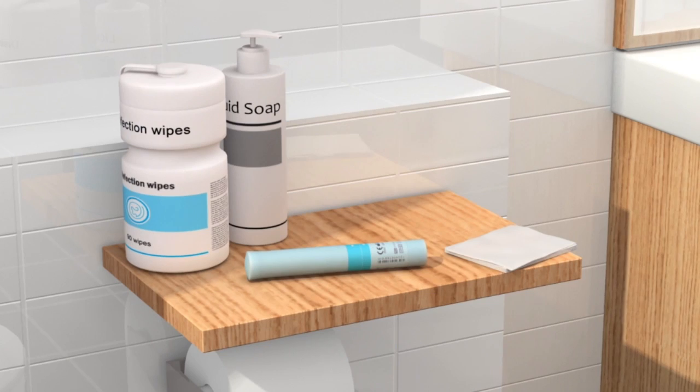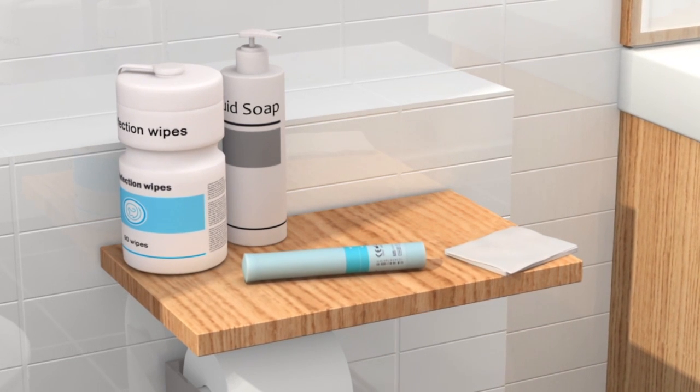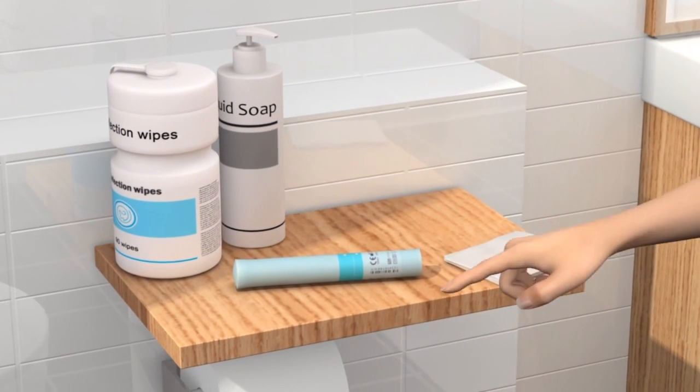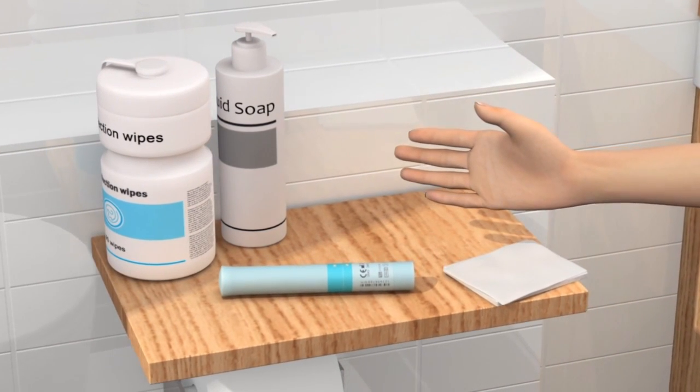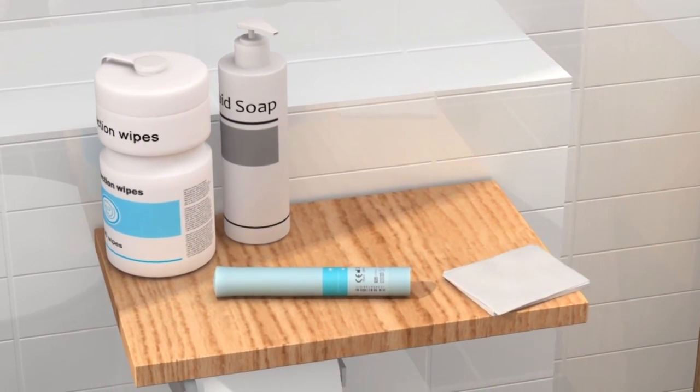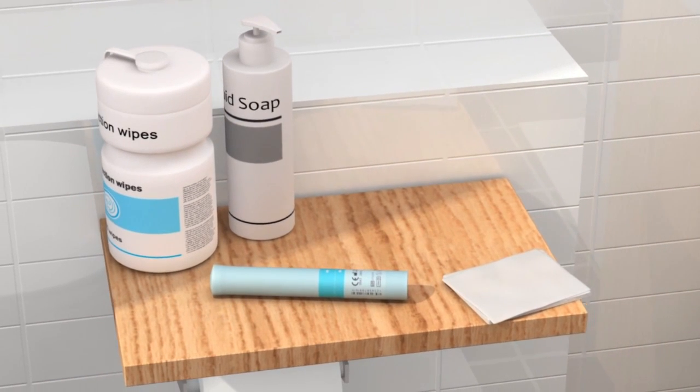Make sure you have all the equipment you will need ready before you start to catheterize. You will need a catheter set, sterile wipes, or soap with a neutral pH value and water. And perhaps a mirror which can be fastened onto your thigh.